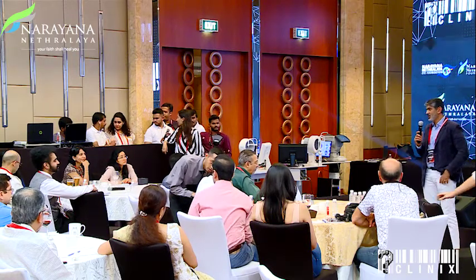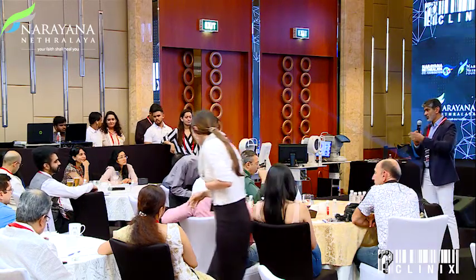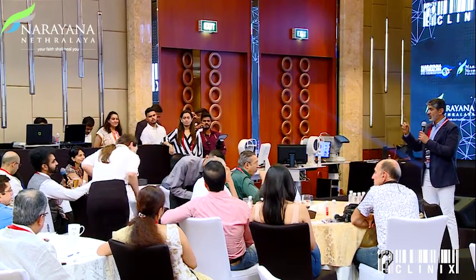Because he has his new nomogram. He has observed certain things and developed a nomogram where he is able to get almost 82% of his eyes within 100 microns of predicted vault, which is very good. That's really good, because 2.8 is also okay if you're a skilled surgeon and you have your nomograms right and your sizing right. But you have to realize that at 2.8, if you have a low vault, the lens is going to grow with time, and then your vault is going to get shallower as the patient becomes older. And then if you have a touch, the risk of developing cataract is more.